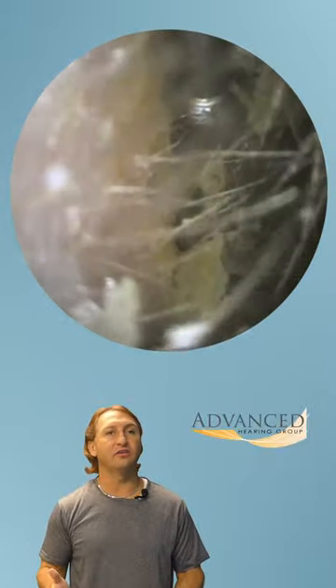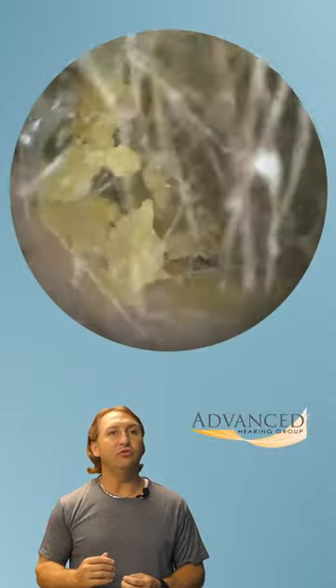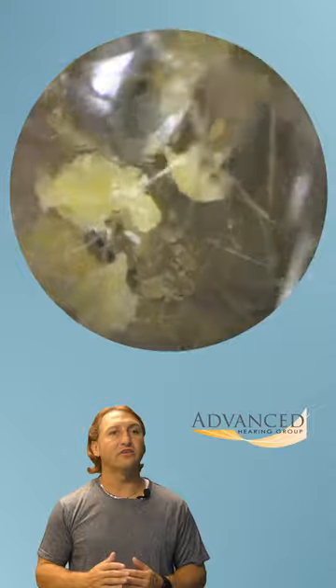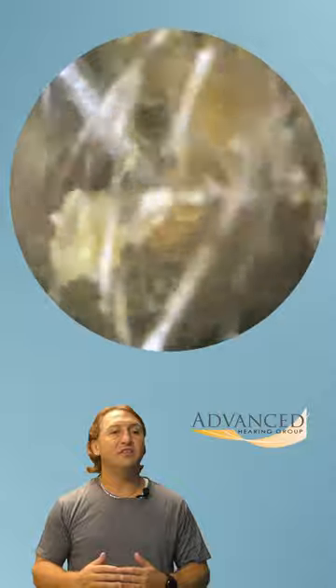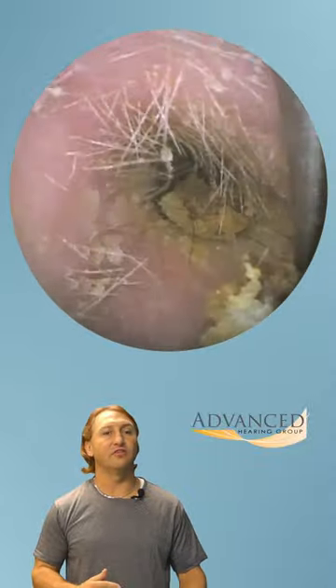They came in to see us with a complete impaction of one ear. The other ear looked great. We're going to use the curette to remove this very hard earwax and see if we can't improve their hearing, reduce the fullness, and make them overall feel better — more balanced one side to the other.